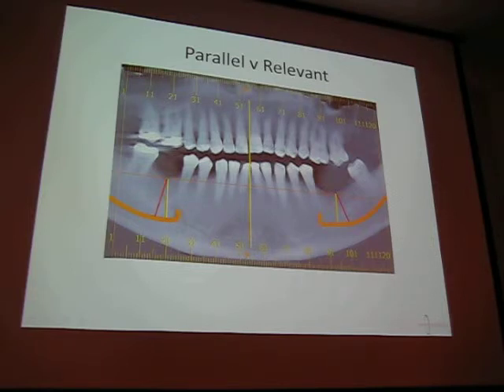But is that really the angle you're placing the implant? You have a curve of Spee. The jaw's not flat. The world's not flat. I learned that with my whole Greenland thing. Your face isn't flat. You learned that with panos distorting 25%. Your jaw's not even flat, unless you're Jay Leno. And so you start curving back.